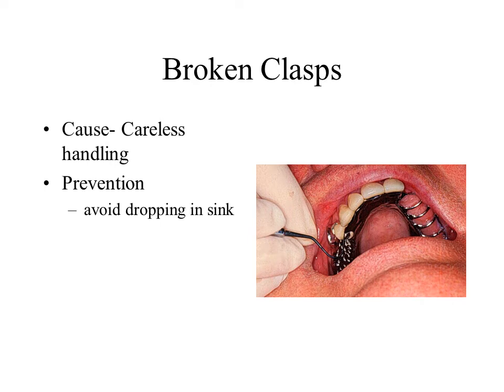Patients may use the clasps for removing the RPD. They should be advised against this maneuver. Careless handling and patient home remedies may cause breakage.